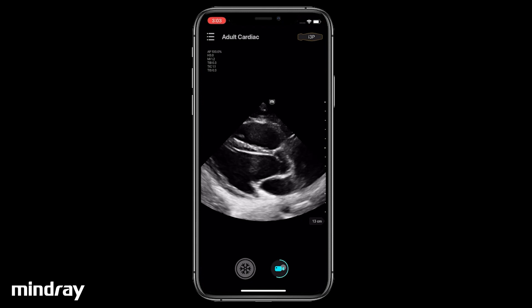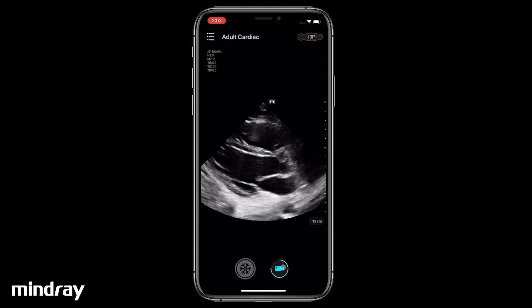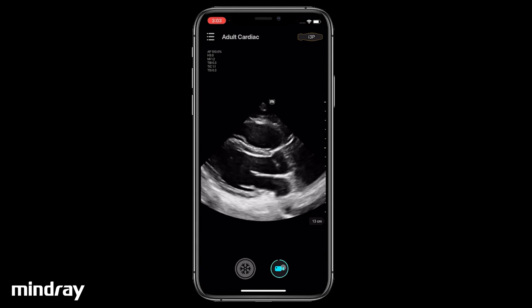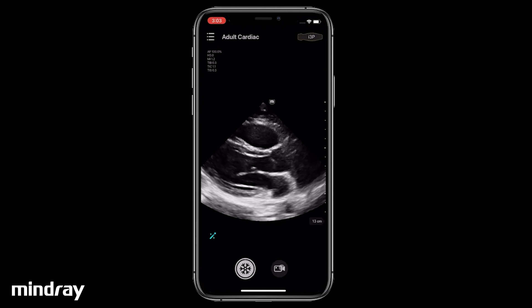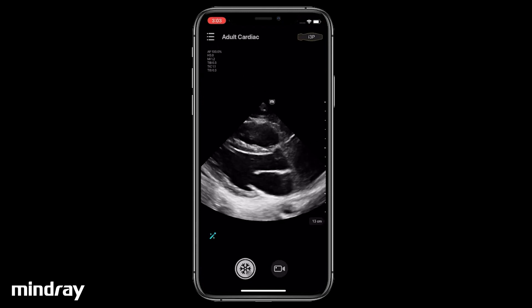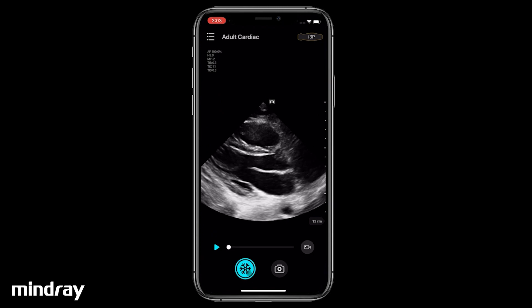Tap the video camera icon to save a cine in real time during scanning. After freezing, tap the camera icon to save an image, or tap the video camera icon to save a cine.